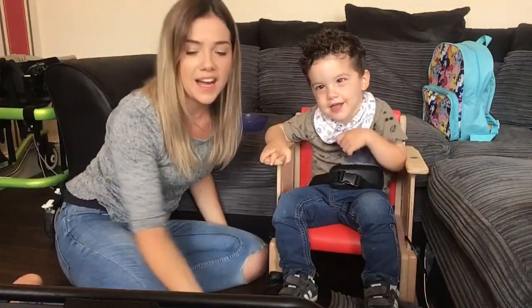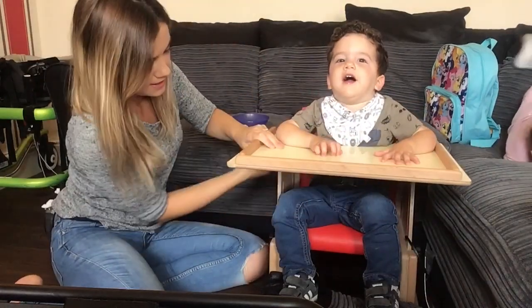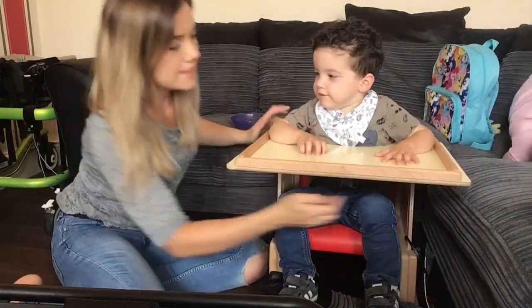So you just slide that tray back on — arms up. So that's what it is — the Heathfield chair.